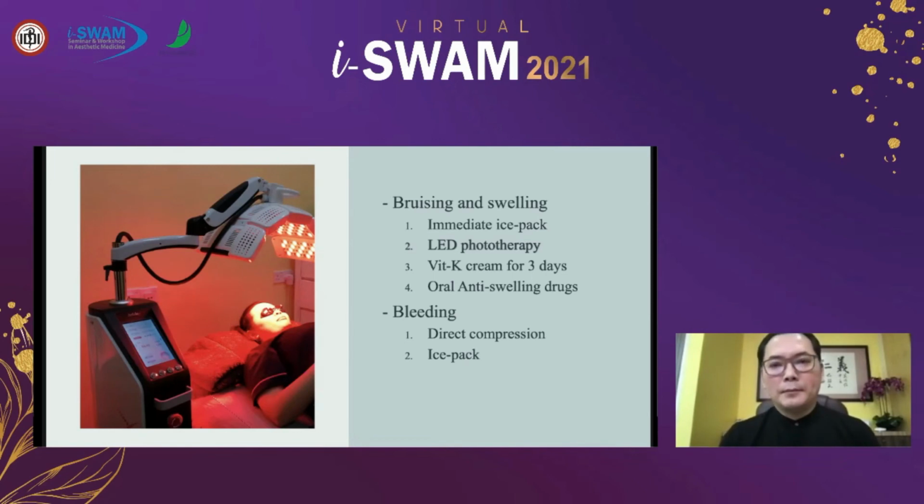I'm sure most centers use this LED light. It works really well. For all our procedures with any pricking, needle or cutting, we put the patient on this LED light for 1 day to 3 days or 5 days, depending on what the patient needs. If the patient wants to come back any day, just put it on. It will reduce the swelling faster.